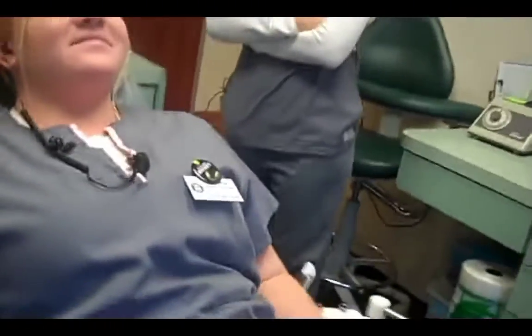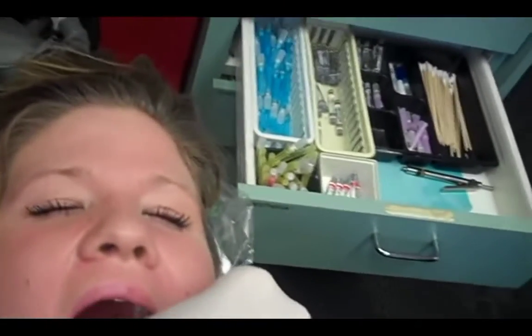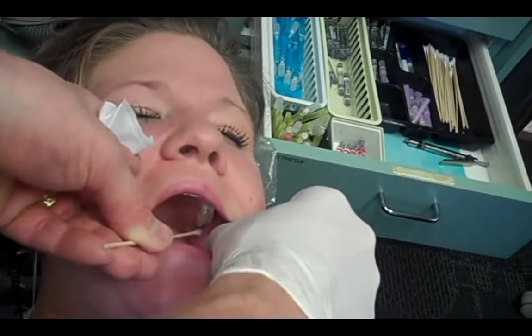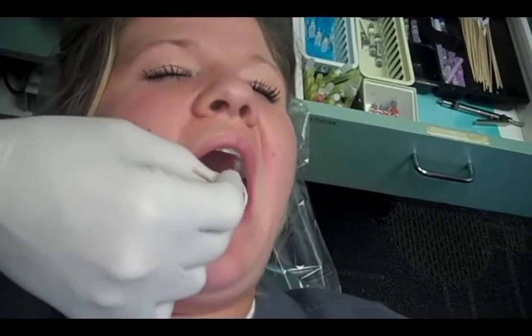If I'm going to do a block for April, the first thing I'm going to do is get my topical and place it. Okay, open really big. Here's where I'm giving my injection on the lower. This is how I figure it out. I feel back here, so I feel the edge of her jaw, and then where my thumb is, we go halfway through there and 1.5 centimeters back. So I know I'm going to give the shot right there. I'm going to place my topical right there, cover it up like that, and we're going to let that set.